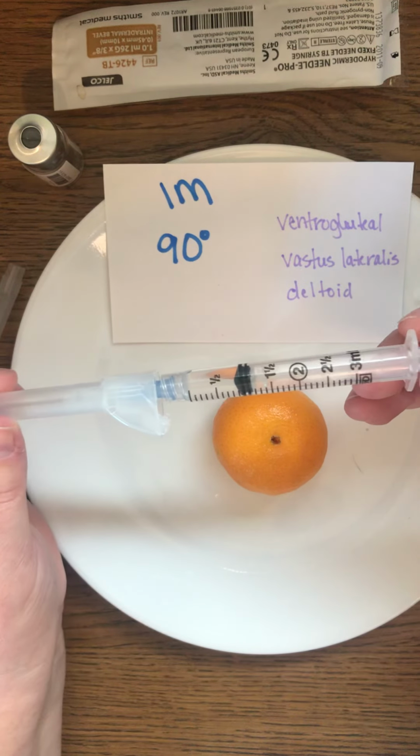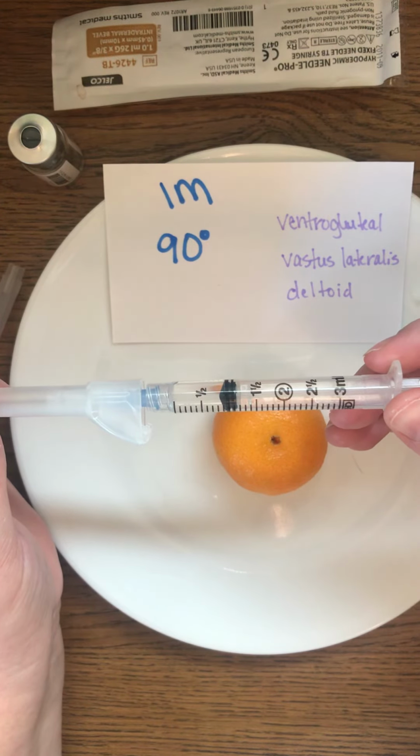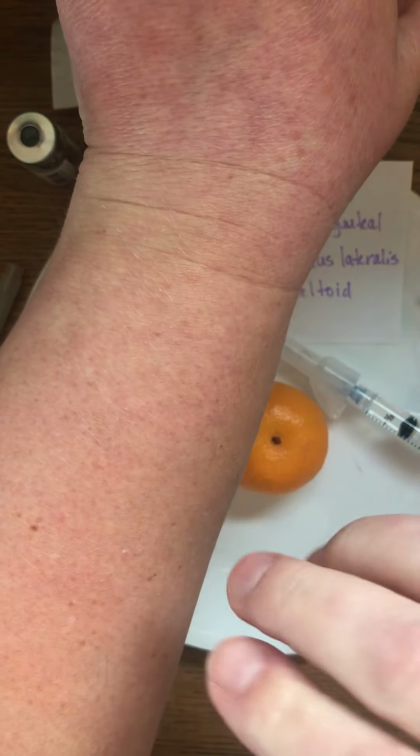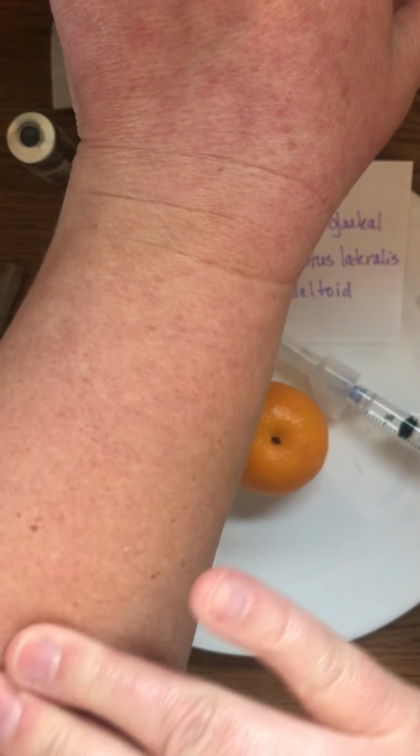We use what's called a Z-track method, which is recommended when giving intramuscular injections. That is where, if I was going to be giving the injection on myself, and say this is the part where I'm going to give the injection, I want to pull the skin down, give the injection, and then let the skin go back into place. It kind of locks the medication in the muscle when we displace the top layer of skin and tissue, give the injection, and then let it fall back into place. So that's what's called a Z-track method, and that is what is recommended.